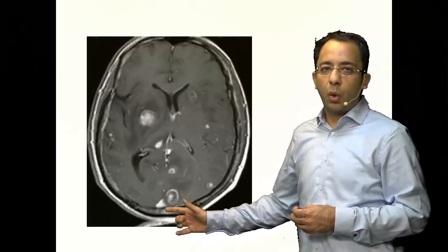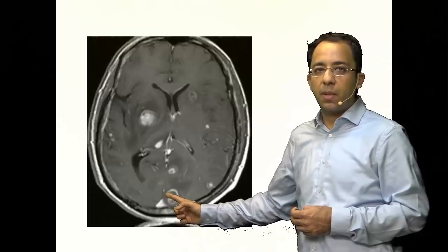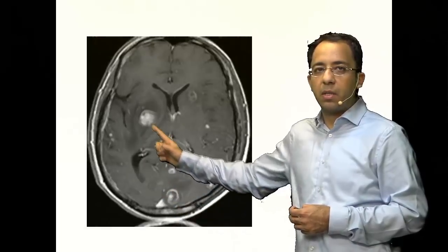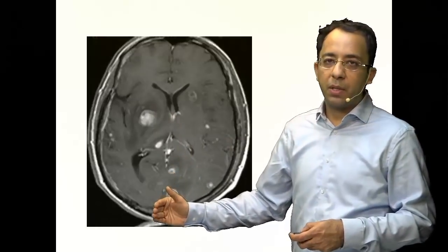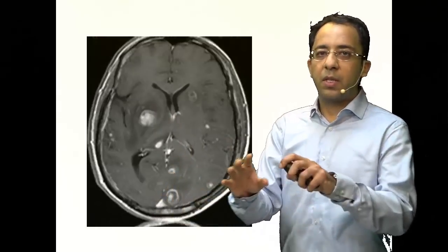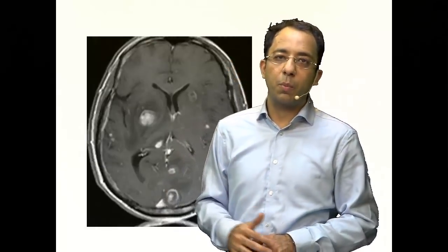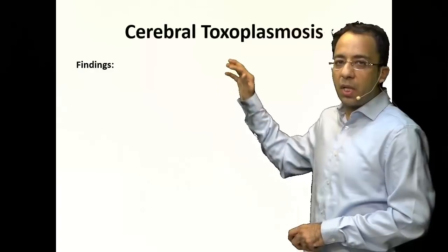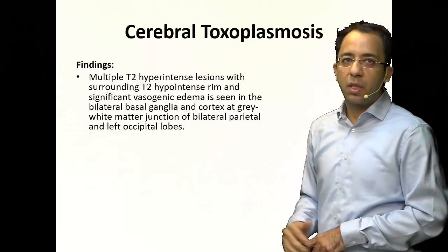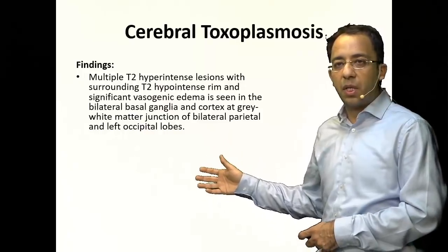Not only do you see ring-enhancing lesions, but you also see an eccentric target-like appearance — also described as a pea-in-a-pod appearance. With these findings and the patient being HIV positive and immunocompromised, this is the classic appearance of toxoplasmosis.